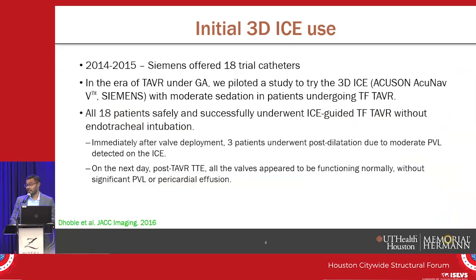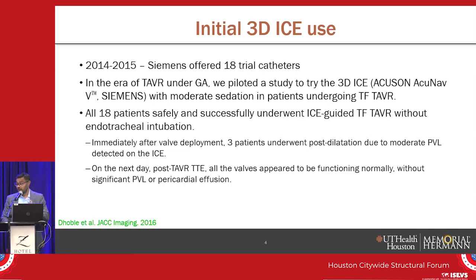However, I must say that initially, the 3D ICE use was very limited in any of these procedures because these procedures did not exist back in 2014 and 15. MitraClip was very early on. The TriClip did not exist. In fact, the first study we did for the 3D ICE was in patients with TAVR. Siemens offered us 18 catheters to do a pilot study, and we did that in the era of general anesthesia while doing the TAVR.